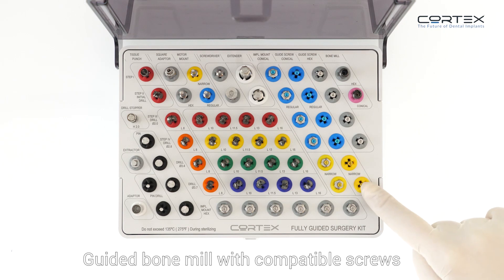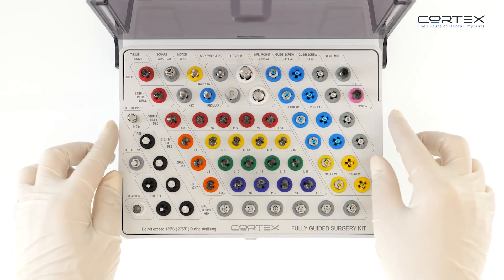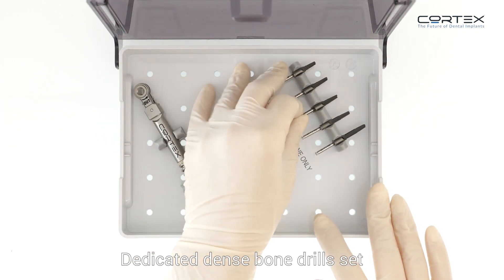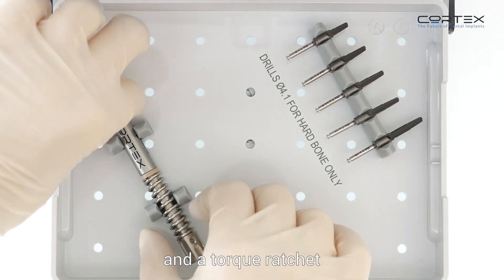The kit further contains a guided bone mill with compatible screws, a dedicated dense bone drill set, and a torque ratchet.